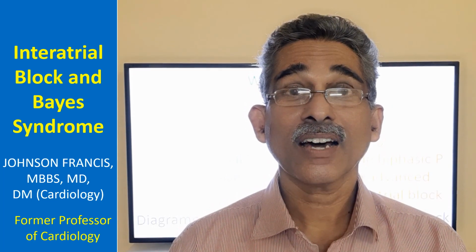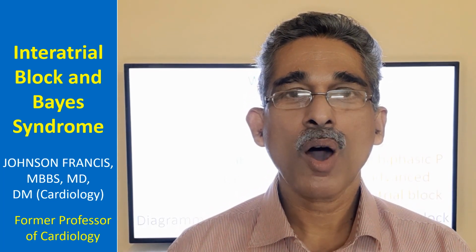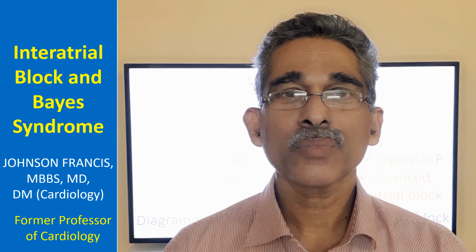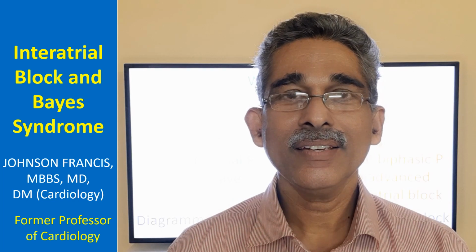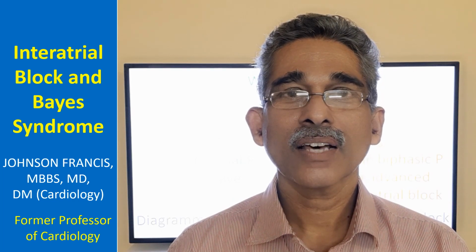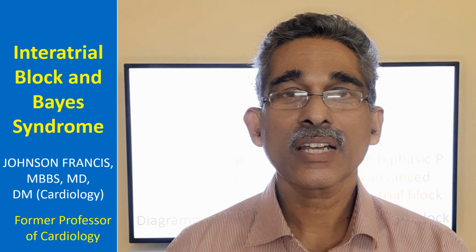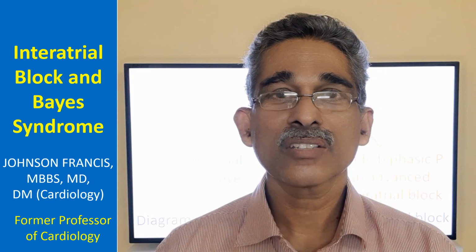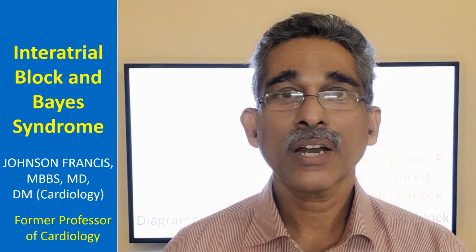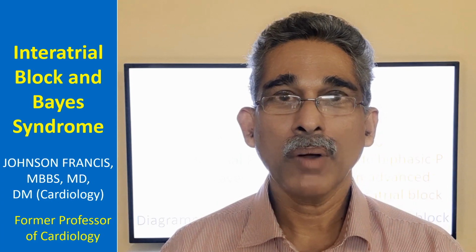Just as there are sinoatrial and atrioventricular blocks, there is also something known as intraatrial block and interatrial block. These are less well-known entities which can be recognized electrocardiographically. And finally, there is something known as Bayes syndrome, which can occur as a sequela of interatrial conduction block.